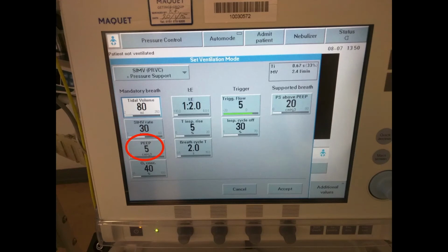If the patient is needing a significant amount of oxygen, and there's significant collapse or consolidation on the X-ray, I tend to use a slightly higher PEEP start, maybe about 8, in an attempt to try and recruit those areas of the lungs. So you've got two options when you've got bits of the lungs collapsed to increase the oxygen to the patient. You can either increase your FiO2.